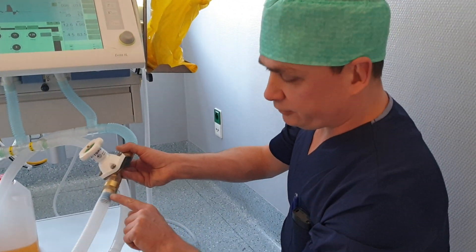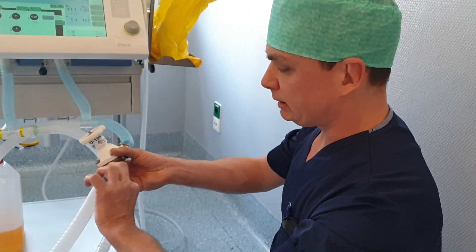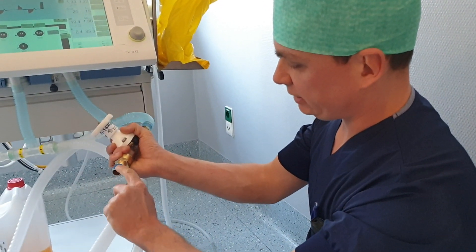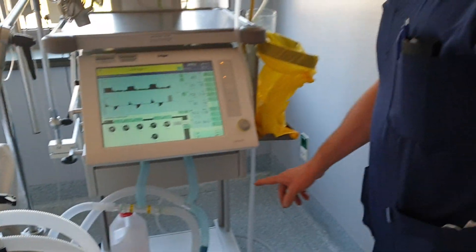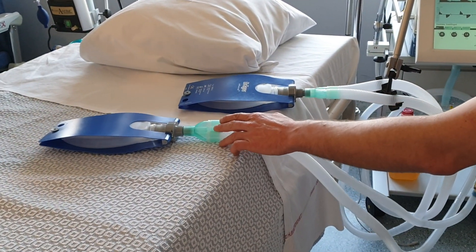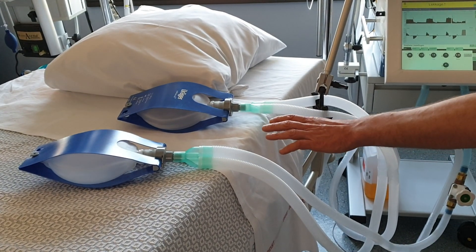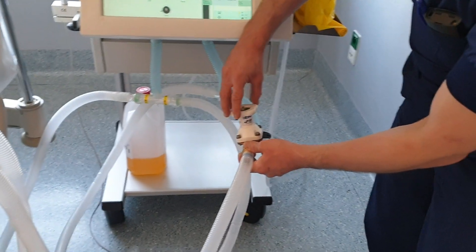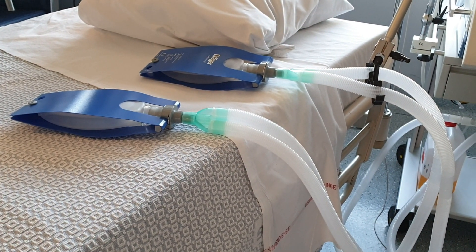If they don't fit really well, you can make them fit with some Teflon tape — the blue tape you see here. You can see the two test lungs now inflate on each tidal volume. If you turn the valve on the inspiratory limb, you can easily adapt the inflation of each lung.